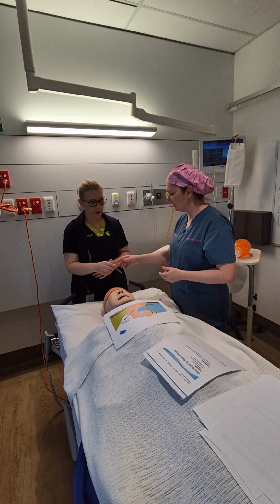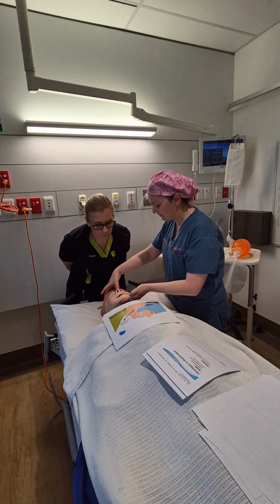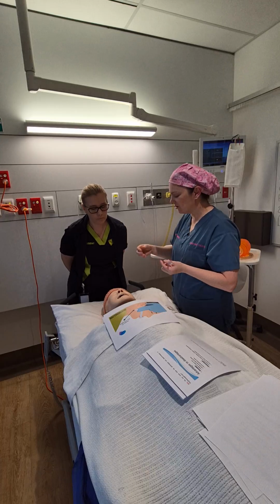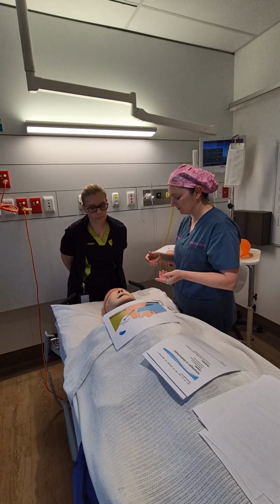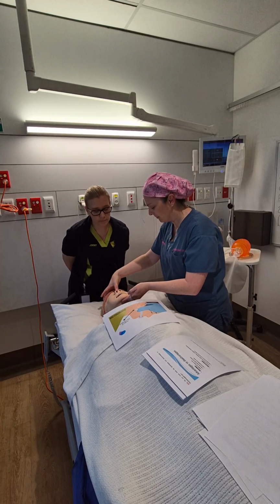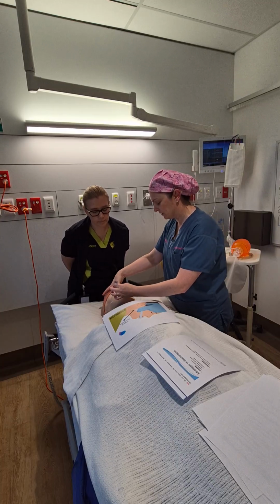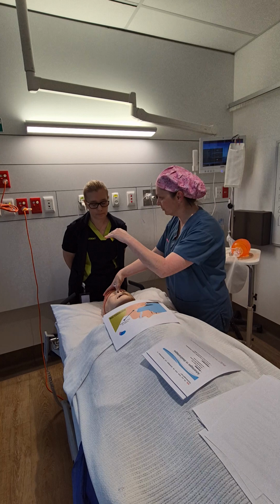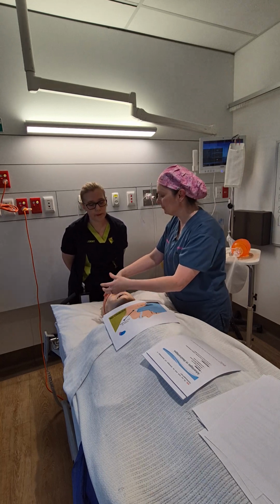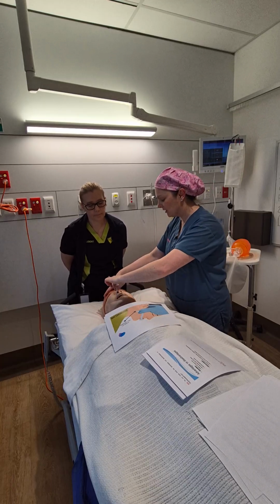I'll just show you how to insert and then I'll let you have it. Okay. So again, do a little bit of the head tilt. Pull the nose back. We always try to go for the bigger of the nostrils. Generally, the right side is bigger than the left, but everybody's different. But we always have a look first, so we pull it back a little bit. We put some lubricant on the tube, and essentially we just pop it in following the natural curvatures of the airway. If you get some resistance, don't force it down because we don't want to cause damage to the airway and get blood in your airway. You can give it a little bit of a turn.